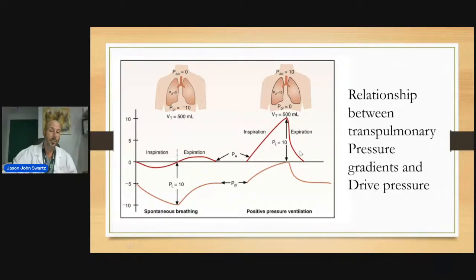And then after, if we have an inferior PEEP, like I said, that means that we have a loss in functional residual capacity. And therefore, let's say the example of 50% FRC of what you should have, or 25%, the fluctuations are this pressure gradient that could be safe, whether it's pleural or drive pressures, but you're talking about 50%, then we should be thinking that, well, this drive pressure is likely being felt as double what I'm calculating, because I know that, let's say, the FRC is half of what it should be.